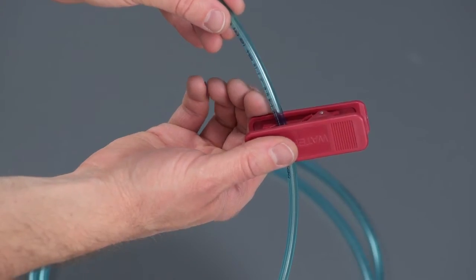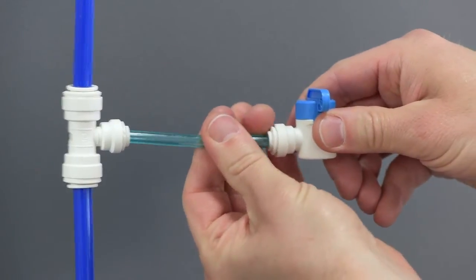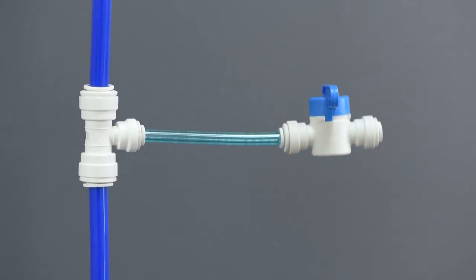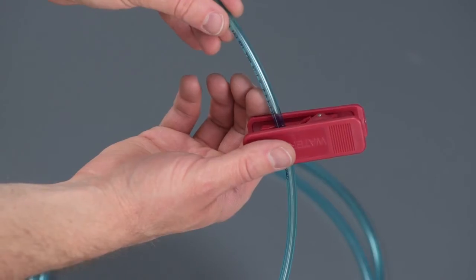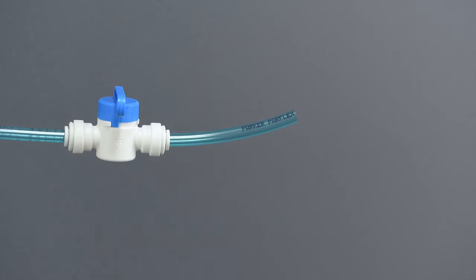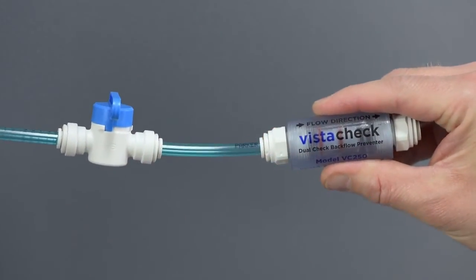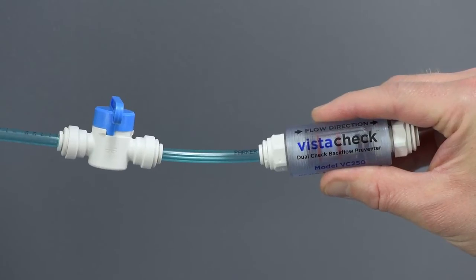Next, cut a 3-4 inch piece of the blue poly tubing and connect the installed fitting from our last step to the inlet of the inline water valve provided. Be sure the valve is in the closed position — that blue lever should be 90 degrees relative to the valve body. Cut another 3-4 inch piece of blue poly tubing and connect one end to the outlet of the inline valve and the other end to the inlet of the supplied CSA certified VistaCheck DualCheck backflow preventer.